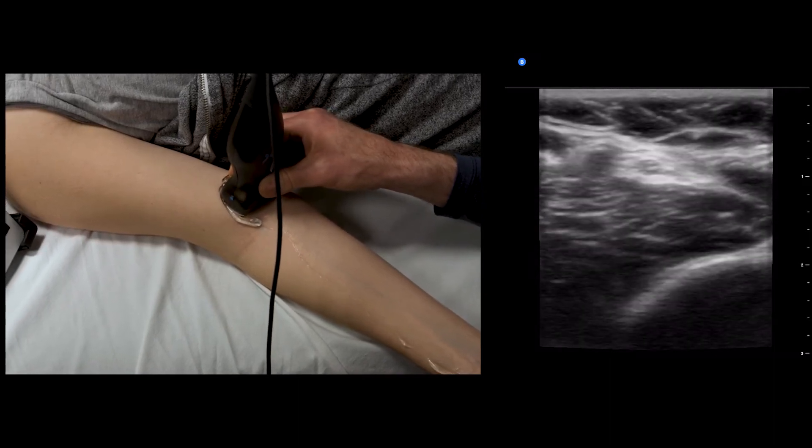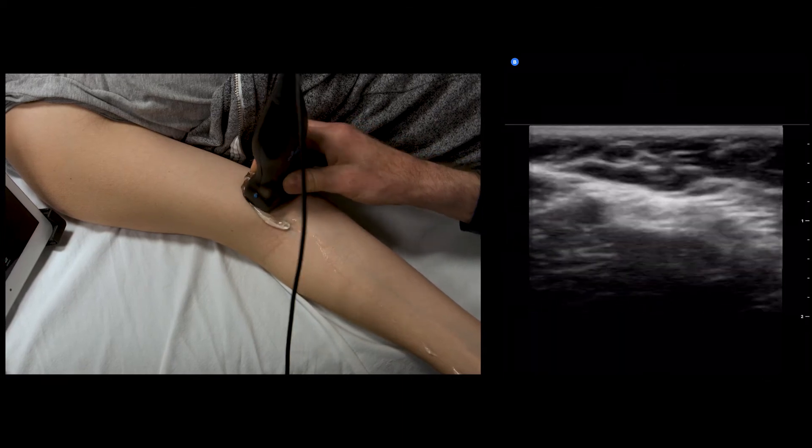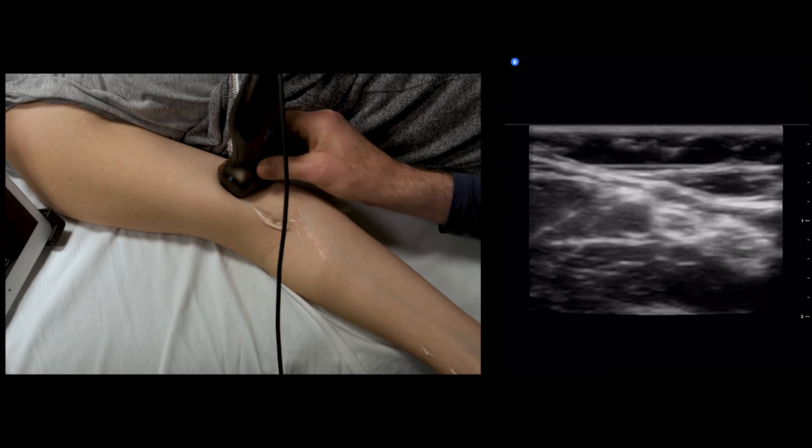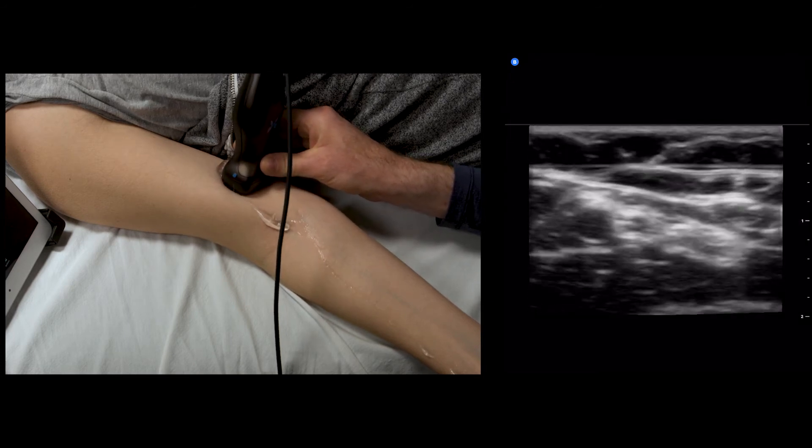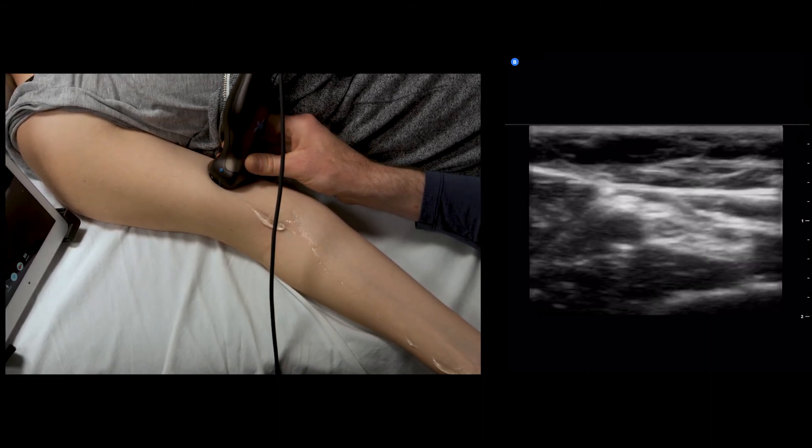Here is the median nerve. I'm going to make it a little bit more superficial, adjacent to the brachial artery. It stays relatively the same in terms of its echo structure and size all the way up to the cords of the plexus.